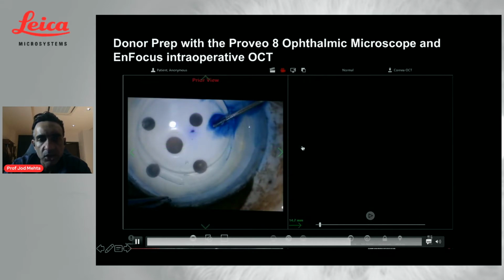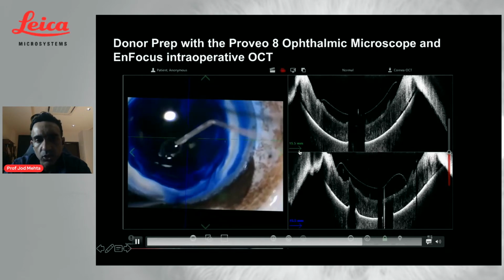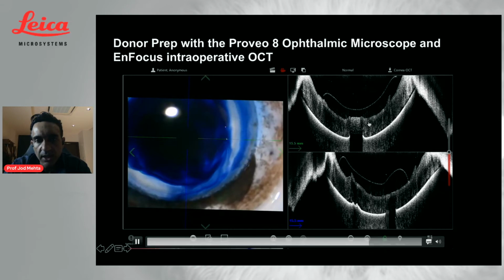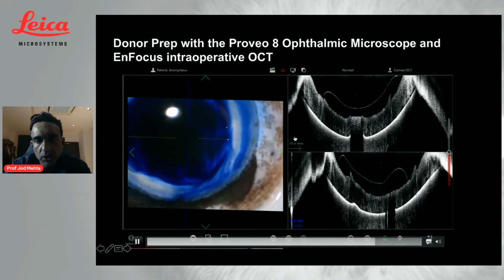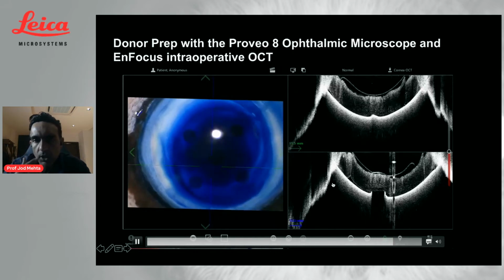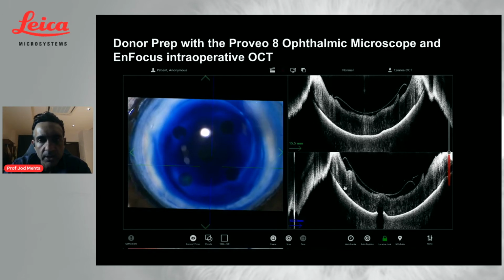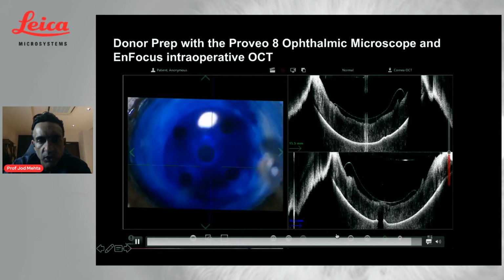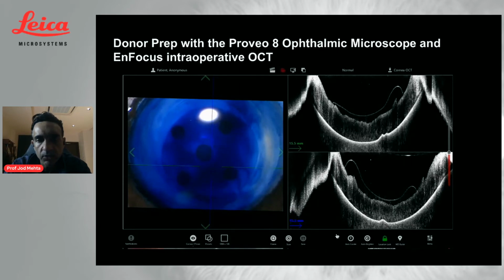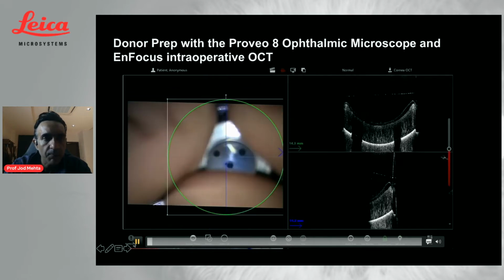Then I will stain the tissue. I use membrane blue for my staining. And it's important when you're staining that you stain underneath the graft. This will again help you, you can see on the OCT, to see how much fluid is in the staining. You can see the fluid has gone underneath the graft itself. So I know I'll get a very nice blue when I keep this for a minute and then wash this away. Once it's stained for a minute, you wash it away, and then you get a very nice dark blue color, which is useful, especially when you're doing complicated cases when the view cannot be so clear.